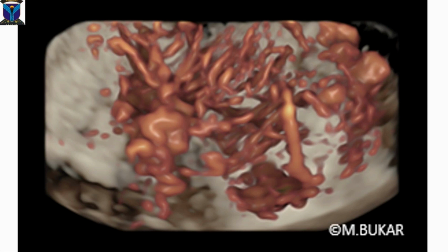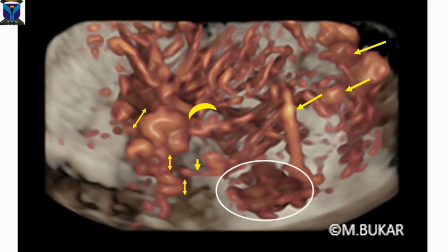Now in this image, we can see virtually all the features of malignant vasculature described in the literature. Here is looping, another looping, and many more loopings here. Here you can see stenosis, dilatation. Here, look at branching. And here, you can see all these features. You can see a looping here, stenosis here, dilatation, branching.